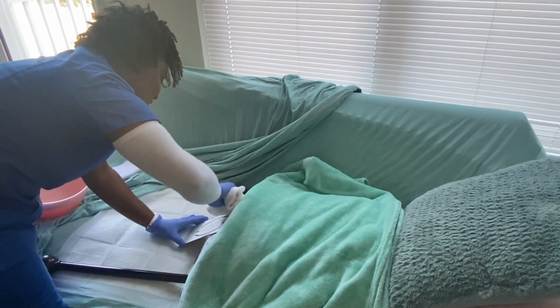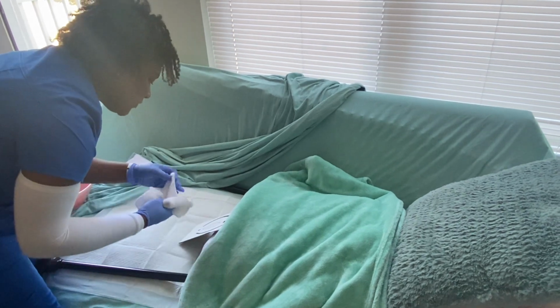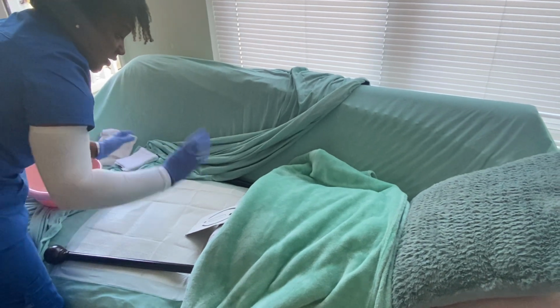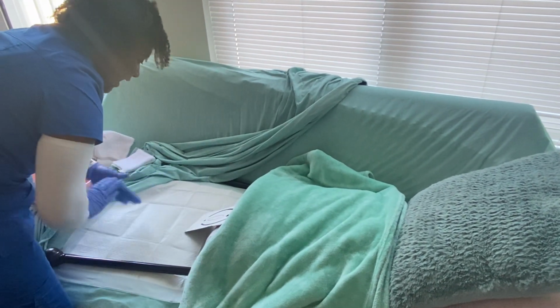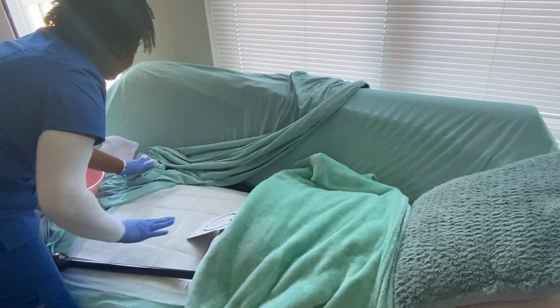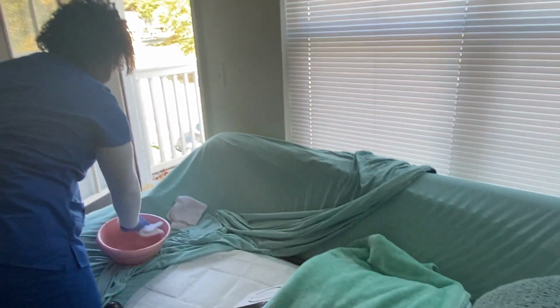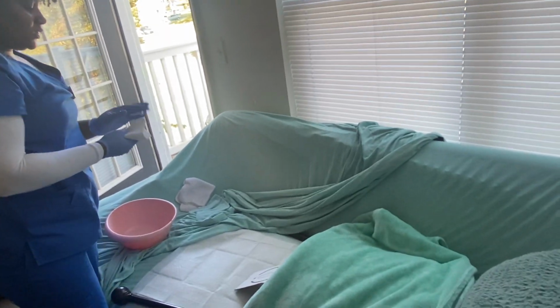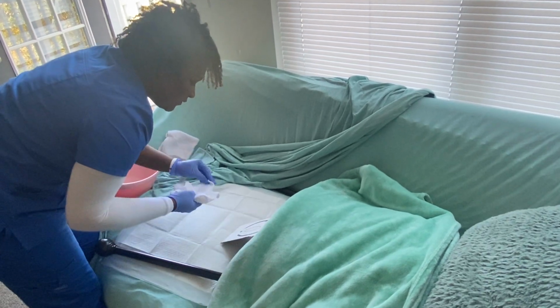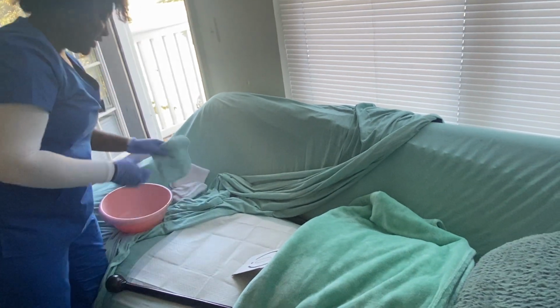So I'm going to wash your left side, fold the towel, wipe your right side, fold the towel, and I'm going to wipe down the middle. But I do see that your urinary meatus is intact. Everything is pretty good down here. There's no type of redness, rashes, or any displacement. And I'm going to use a towel to rinse off your perineum. Fold the towel, wipe down the middle. Okay, so now I'm going to get ready to dry you.